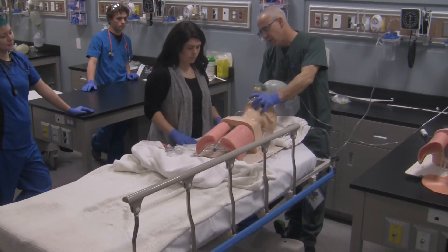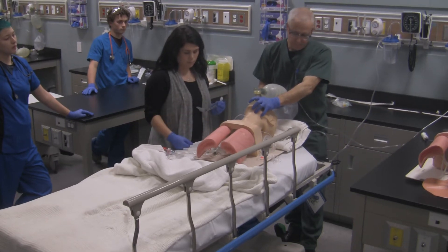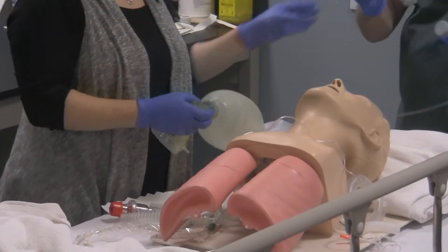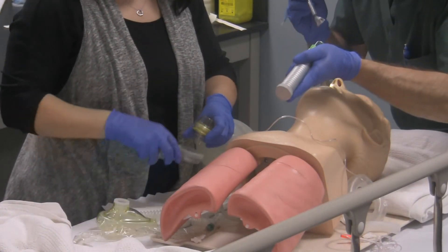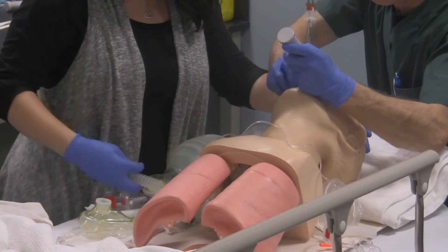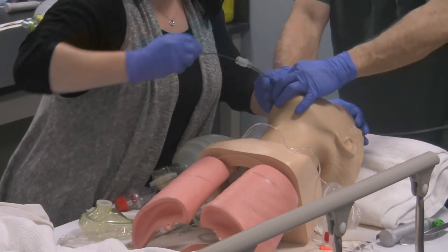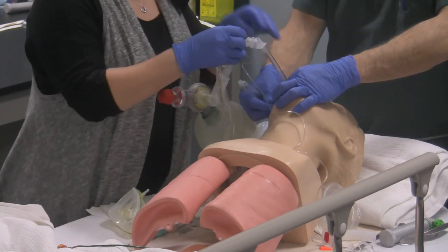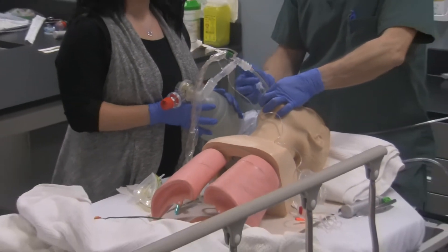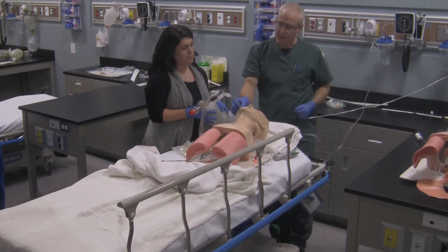Donald, we're getting that breathing tube now into the back of your throat. Next breath. I've got the OPA. Let me see chest rise — looks like we're getting some end tidal CO2 back, about 60. Condensation in the airway.